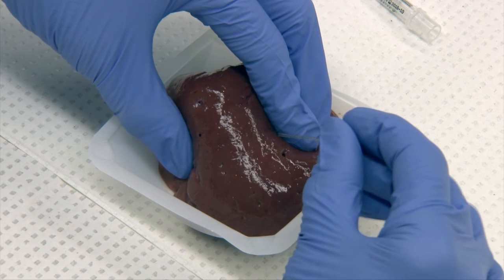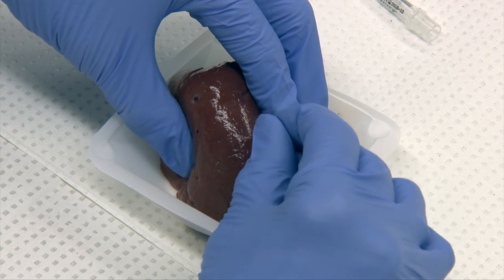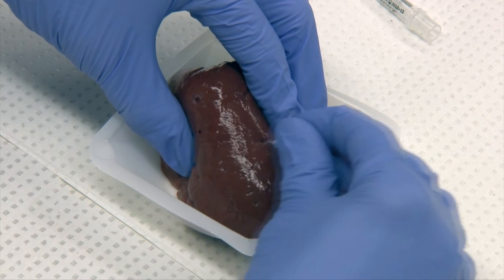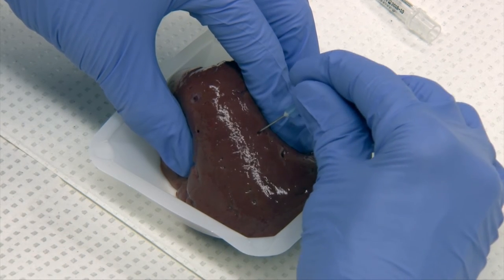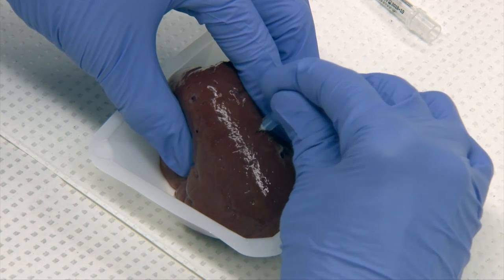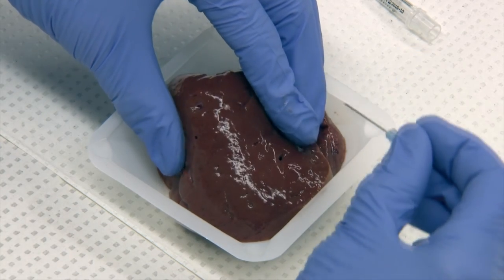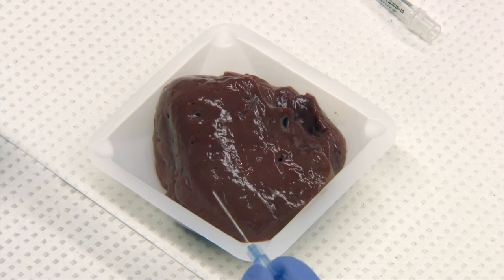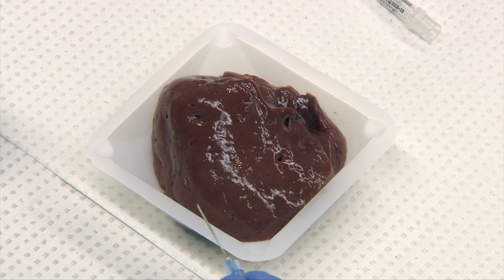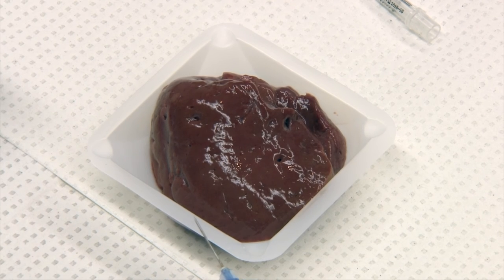What you'll do is take the needle and just stab it into the tissue, and while you're still in the tissue, redirect that three to six times at different angles within that tissue. Then when you're finished, you'll take that needle out of the tissue, and at that point you would attach a syringe containing air and prepare your smears just as we did for the regular fine needle aspirate method.